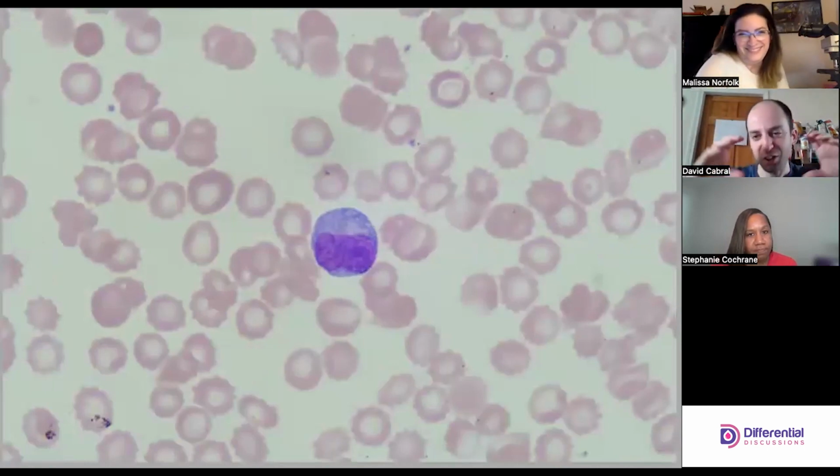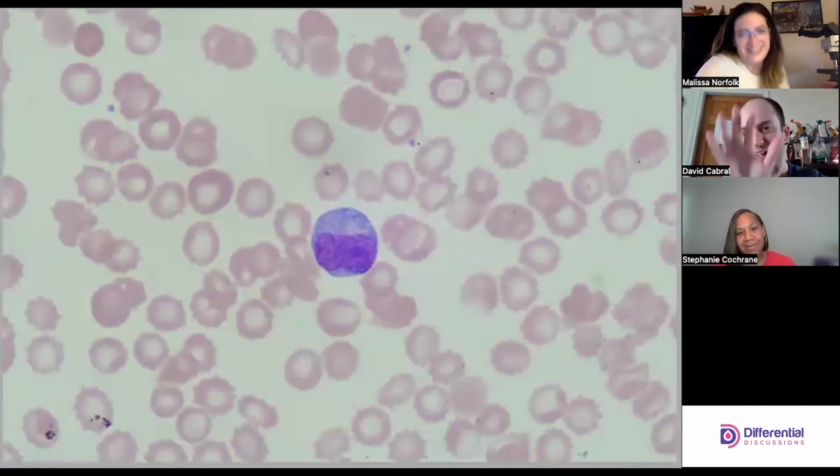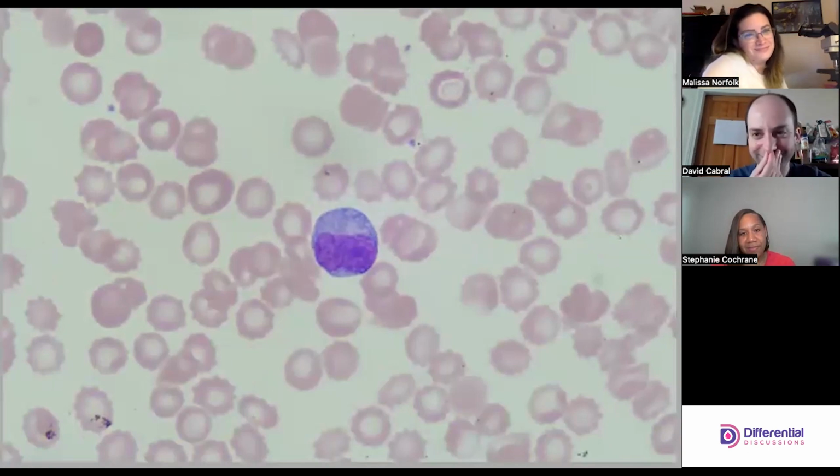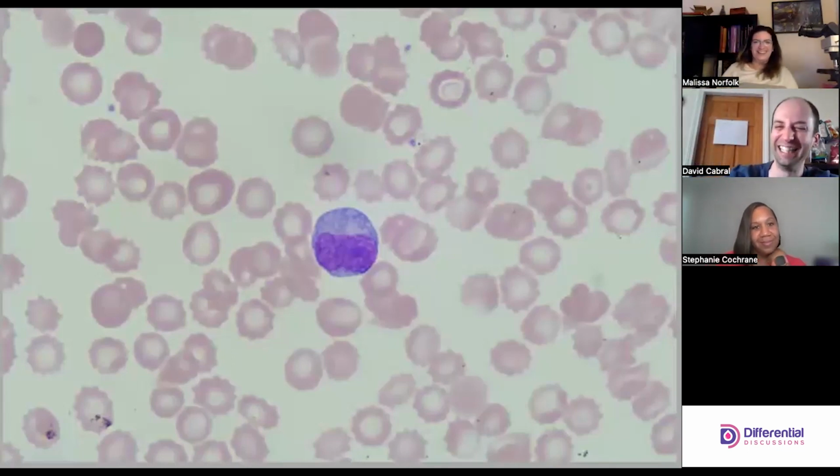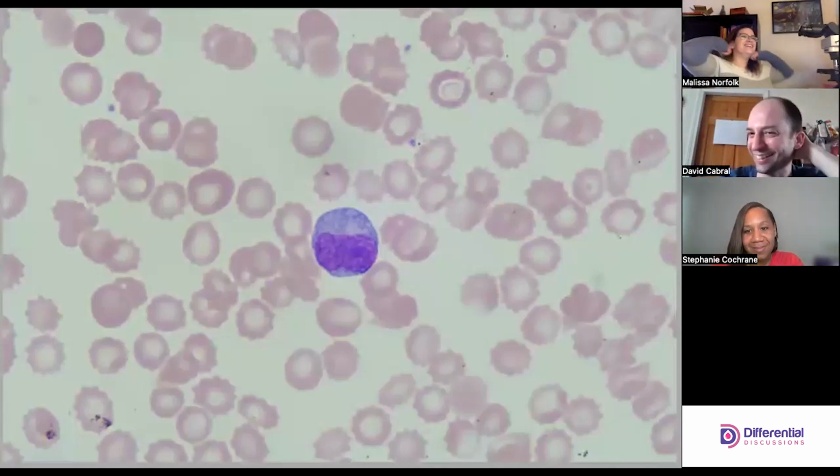So it looks like it's folded. It does. But it looks reactive, right? Yeah. It's an angry mono. Yeah, so these look like what our pathologist would say are reactive histiocytes, right? It could be that too. Yeah. I just had her kind of echo it in the back of my head.